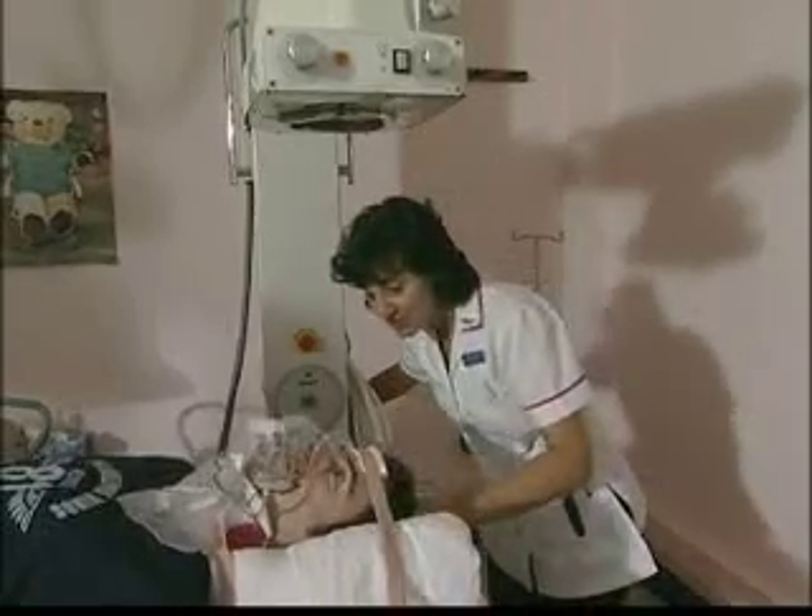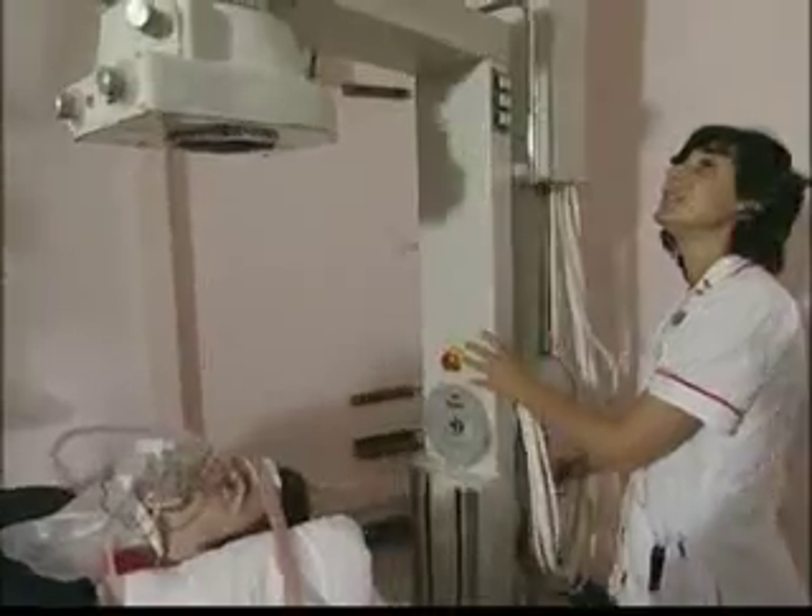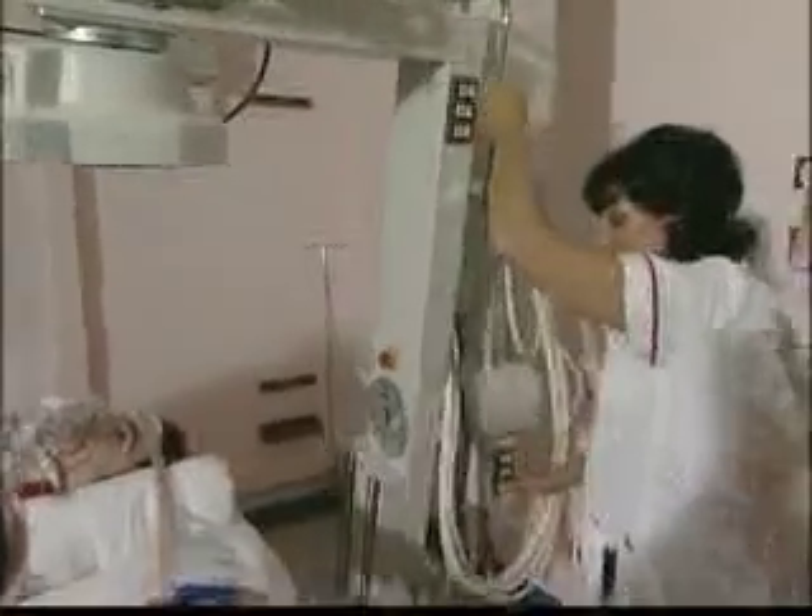I'm now going to turn our machine upside down. In the case of a skull X-ray, it's very important to avoid the eyes if possible, as they're sensitive to ionising radiation.